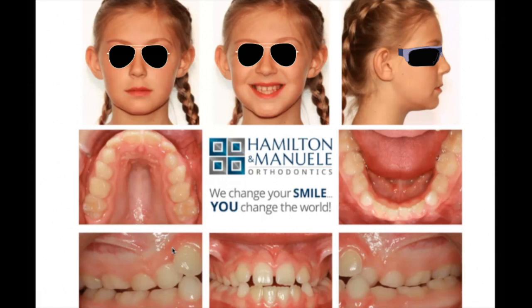Is it an 8-ounce elastic? Is it 12 ounce? And they do grams and ounces. I typically in my office talk ounces just because we're in America and that's what they do. But all the literature usually points to grams, so you have to do the conversion. But yeah, typically somewhere between 8 and 12 ounces per side.